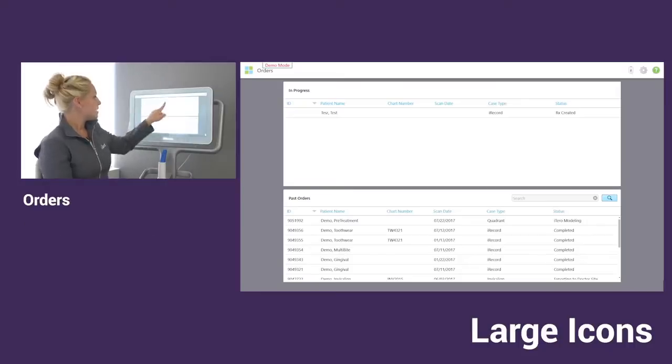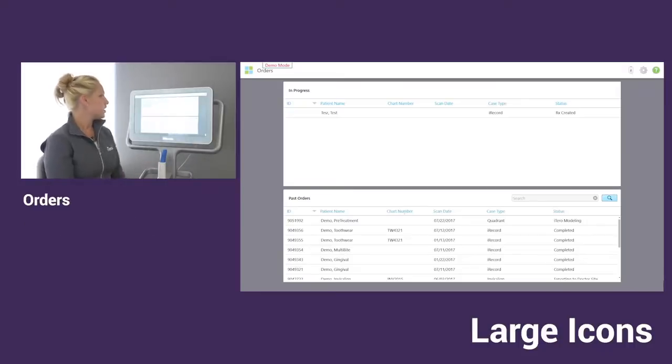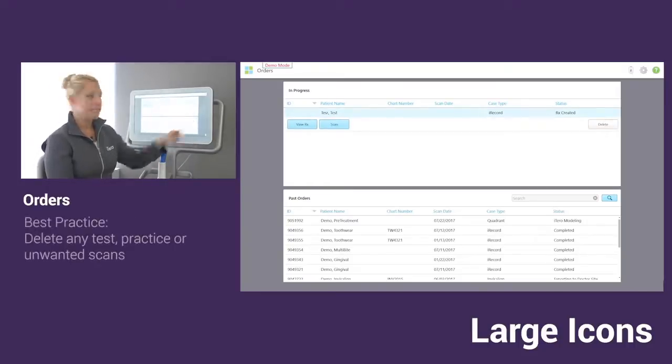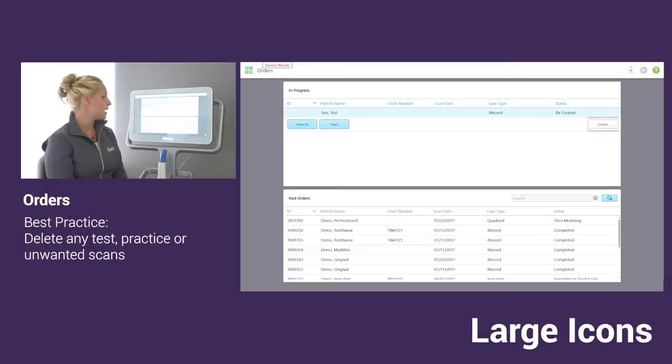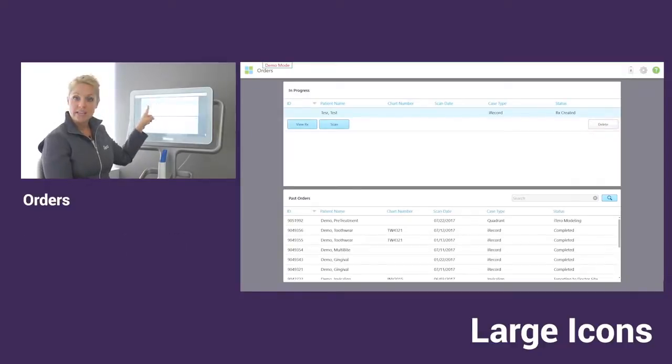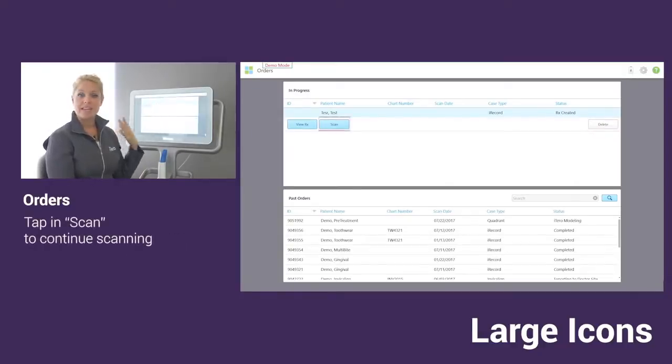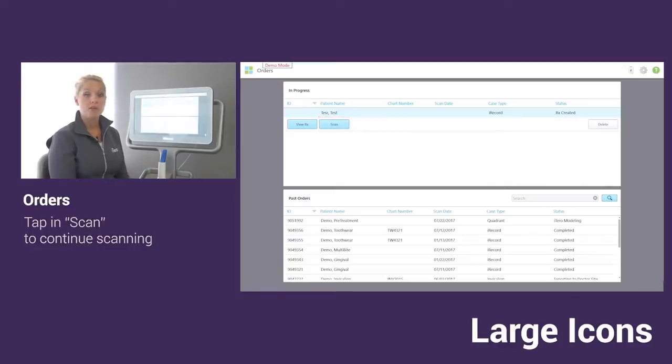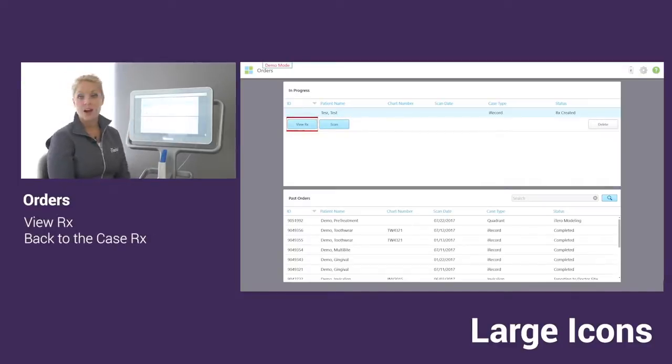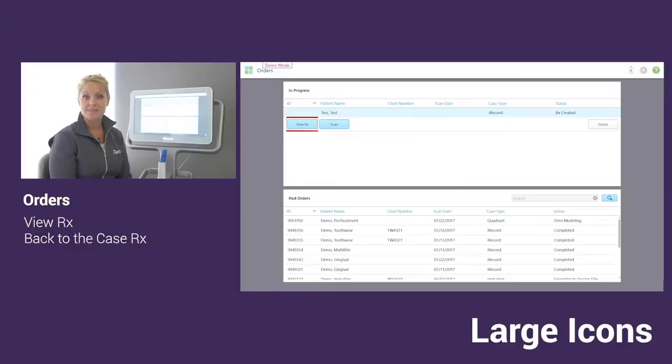I can tap right on the scan. You will see that we have the option to delete over here to the right. If I wanted to continue scanning, maybe if I didn't get a chance to finish, or if you wanted to view what you scanned, you can do that as well along with going into the Rx.